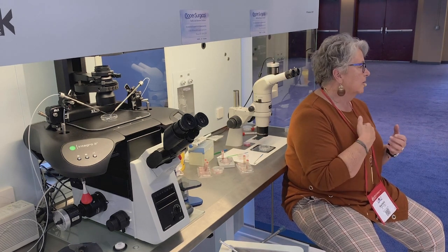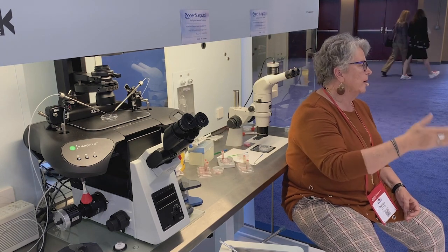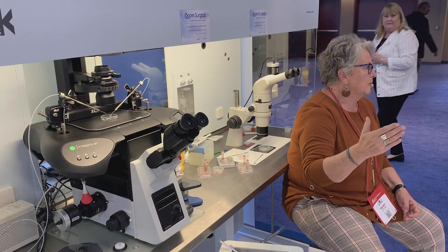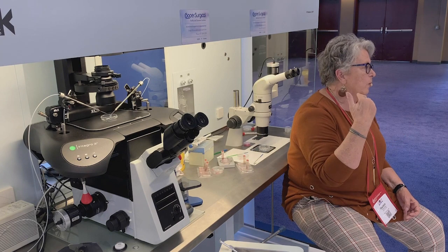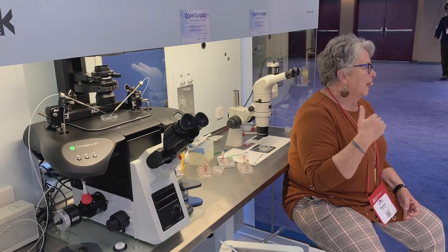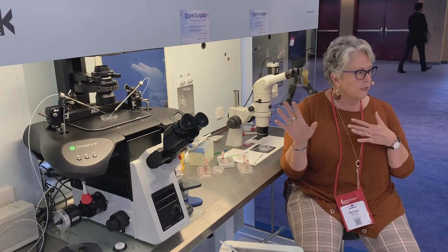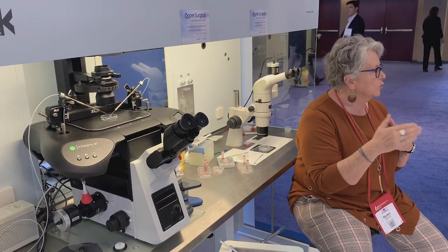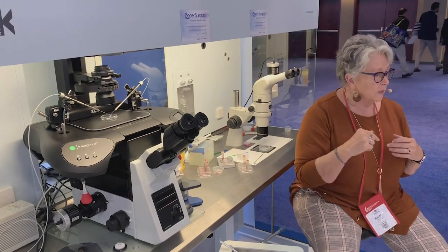So we decided in our lab doing blastocysts that we were going to leave them in there for 8 minutes. We didn't want to leave them for 15 because we didn't see any reason to leave them longer than we knew that they had already equilibrated. So we went with 8 minutes, and that's worked well for us. So I've already set up the dishes here. We've put 300 microliters of equilibration solution and 300 microliters of the vitrification solution.